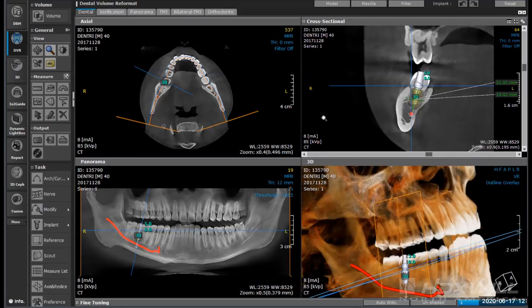Now, for those of you who don't understand what an STL is, it's a file from when you do an intraoral scan. So the intraoral scanners that you can use to get that information, and with the information from a DICOM and from an STL, those are the two things that you would use to combine in tertiary software like Blue Sky Bio, Pro Diagnostics, or send to a lab. And those two things will be able to help them create a guide or a crown model or anything else from those two types of files.